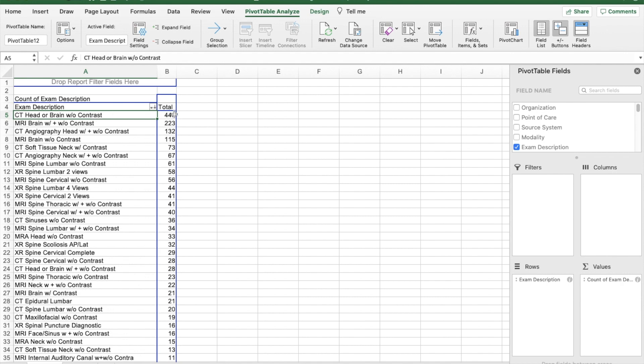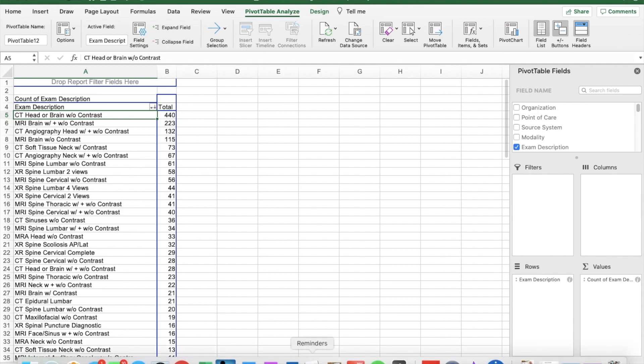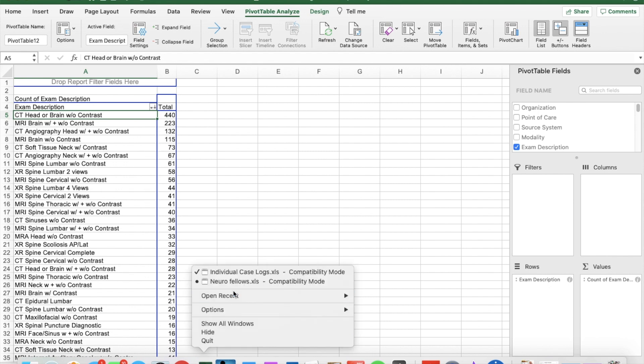If all you need is to make your case logs, you can pretty much stop the video now. But if you want to compare productivity between radiologists, I will show you how in the next step.